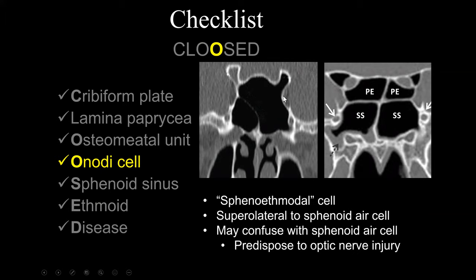A completely opacified maxillary sinus with thickening of the posterior wall — reactive osteitis — is more consistent with chronic disease. We can suggest chronic sinusitis, but again it remains a clinical diagnosis. When the sinus is completely opacified with reactive hyperostosis, small, and shrunken, this is a hypoplastic maxillary sinus — often associated with orbital enlargement and inferior displacement of the orbital floor, which we refer to as silent sinus disease.